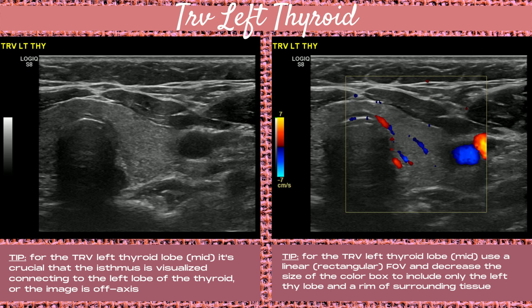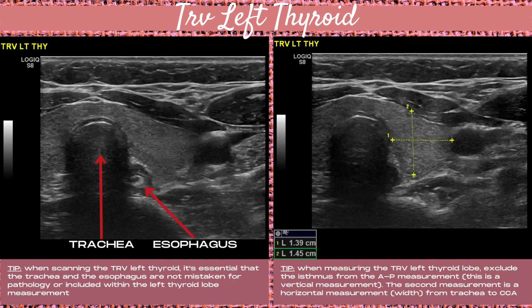Moving on to the transverse left thyroid lobe mid segment. It's crucial that the isthmus is visualized connecting to the left lobe or the image is off axis. Use a linear or rectangular shaped field of view and decrease the size of the color box to include only the left thyroid lobe and a rim of surrounding tissue. When scanning the transverse left thyroid, the trachea and esophagus must not be mistaken for pathology or included within the left thyroid lobe measurements. Exclude the isthmus from the AP measurement, and the width measurement can be measured from the tracheal border to the CCA border.